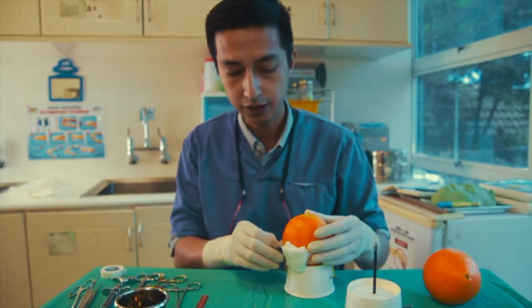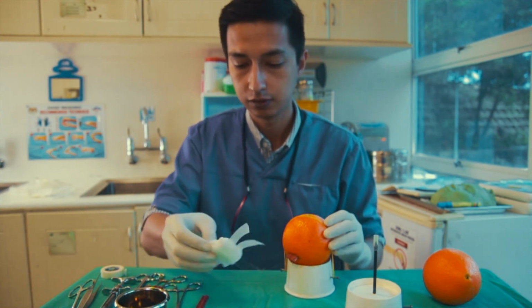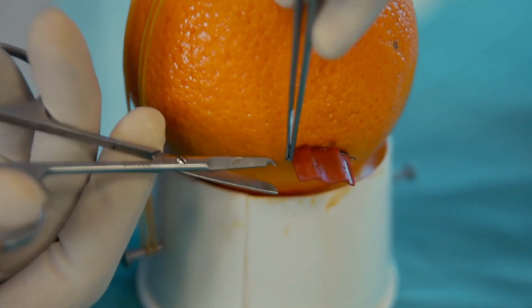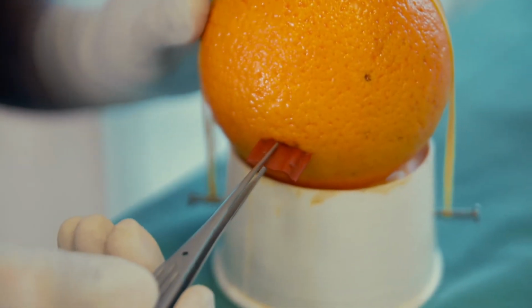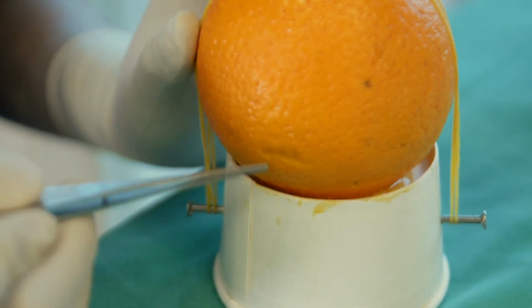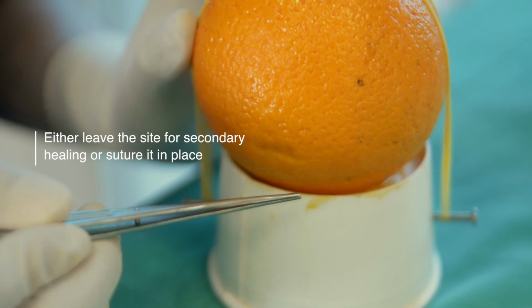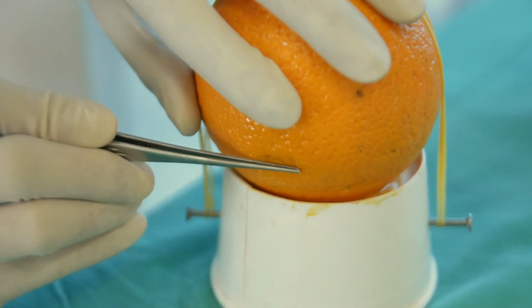At the end of the treatment, when you review the patient and you see there's no more pus on the gauze, you can remove the rubber drain using the suture scissors. You can just pull the rubber drain out. This side, you can just leave it for secondary healing, or you can put some holding sutures to approximate the wound. We have come to the end of our demonstration.